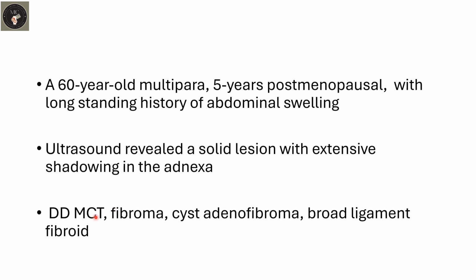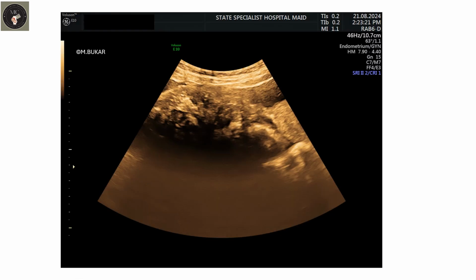Mature cystic teratoma, fibroma, cystadenofibroma, and broad ligament fibroid. So let's see the video and decide which of these is the most likely differential diagnosis.